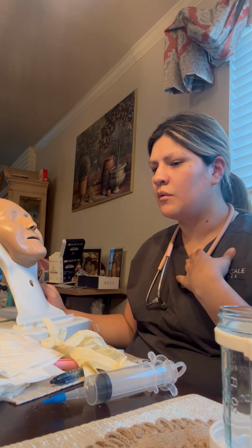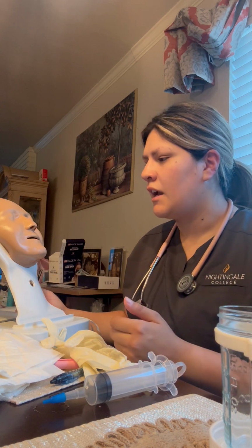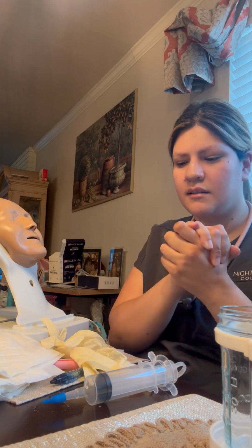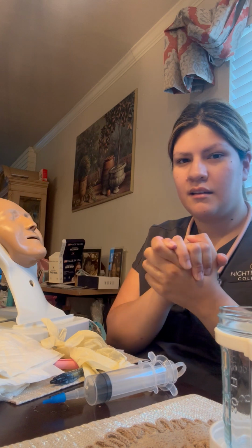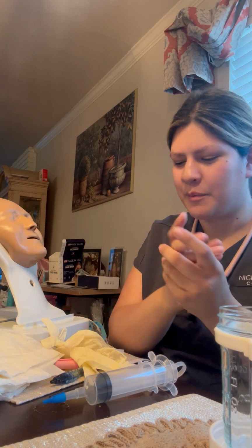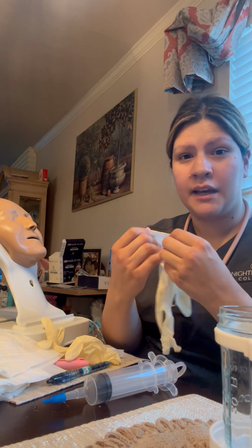I'm going to position the patient in high Fowler's. And I'm going to go ahead and gel in or perform hand hygiene. I'm going to go ahead and put on my gloves.